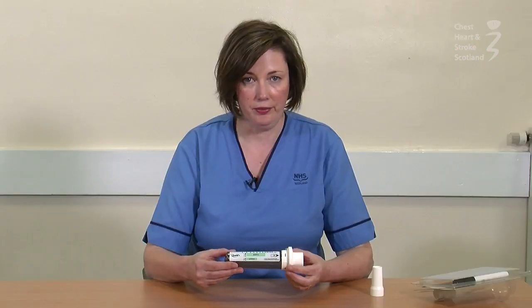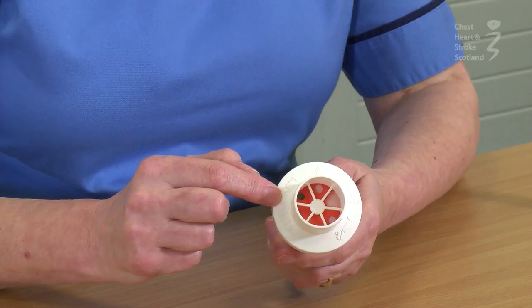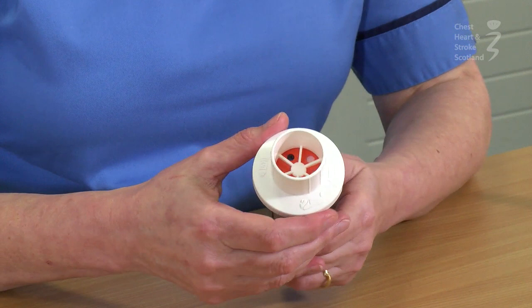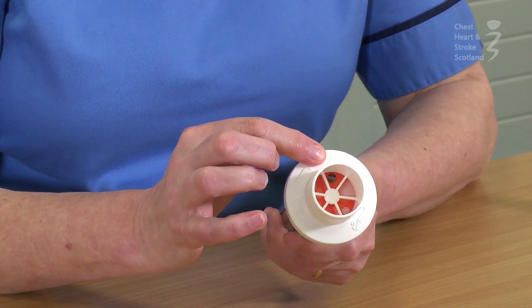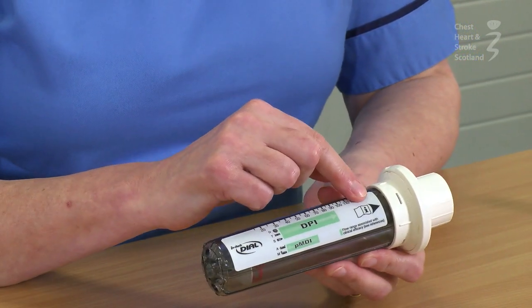To use the InCheck dial, you will see at the top there are different symbols which indicate different inhalers. What you do is turn the dial round to whatever inhaler you want to check and match it up with the arrow on the side.